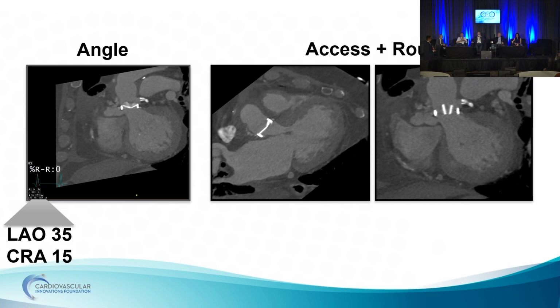I think even just accessing this thing, this is a patient where I might just do a diagnostic cath and a practice run: do your coronaries, your right heart, do a practice transseptal, and see if you can even get a catheter to engage this thing. You're going to need some nested catheter system. The backup's going to be really difficult. The nice thing about the ADO2 is that it's very soft, so it doesn't require as much backup. If you're going to try to deliver an AVP2 or something more rigid, the catheter may just fly out of here. And the other thing is maybe just coils, and start with that and see how it goes.